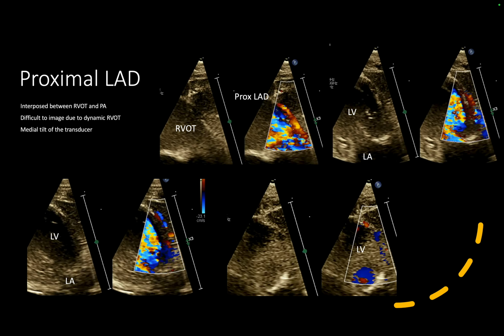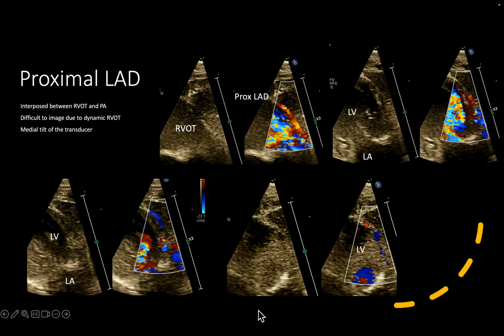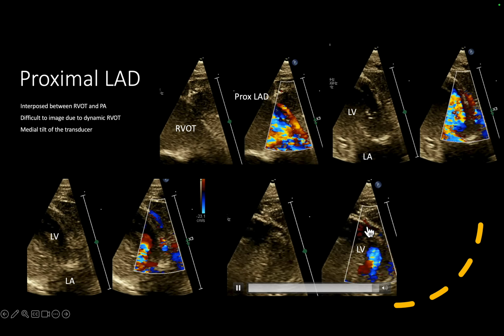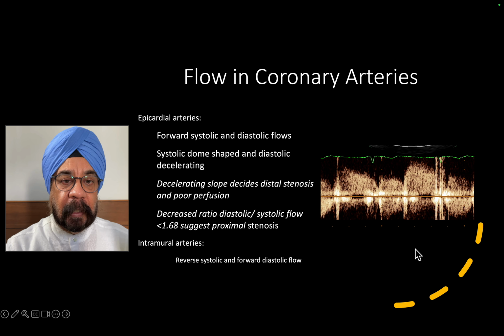Coronary artery at the apical view, where you see this is close to the apex. Again you see a coronary artery with accompanying vein, which is in blue color, and LAD distal is in the red color. So that's again right close to the apex, and you see the LAD crossing the apex and going into the right ventricle. So this is the apical view of the LAD.